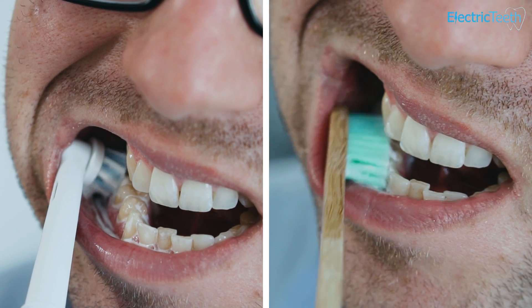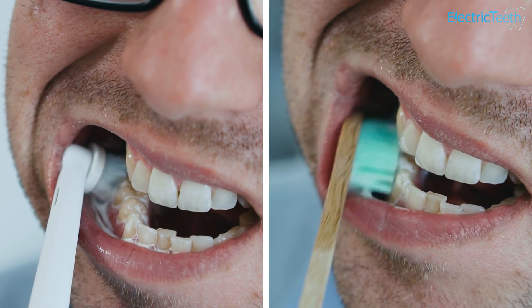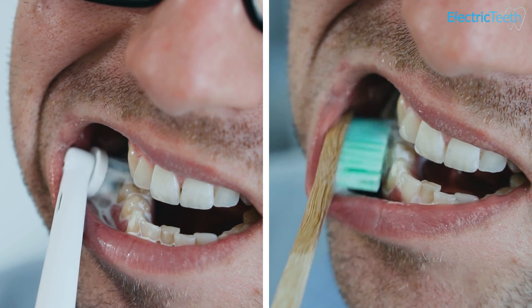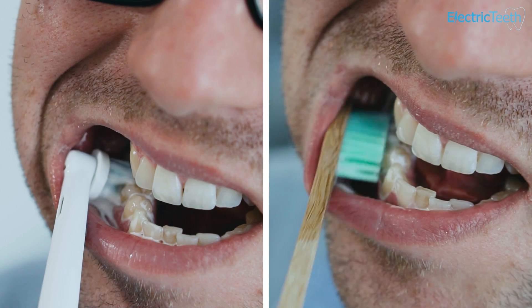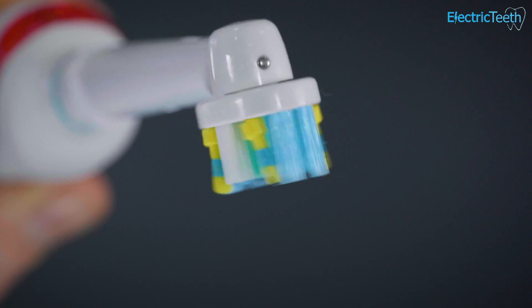As I stated at the top of this video, an electric toothbrush can remove more plaque and it has been clinically proven. I should state that when we say it is removing more plaque, this is in comparison to use of a manual toothbrush. A manual toothbrush, if used correctly, is perfectly adequate for brushing your teeth, but there are benefits to using an electric toothbrush, and studies have confirmed that an electric toothbrush can remove more plaque than a manual brush.